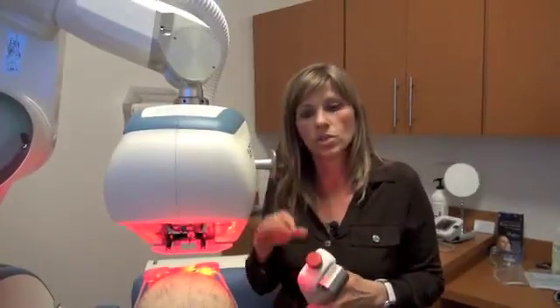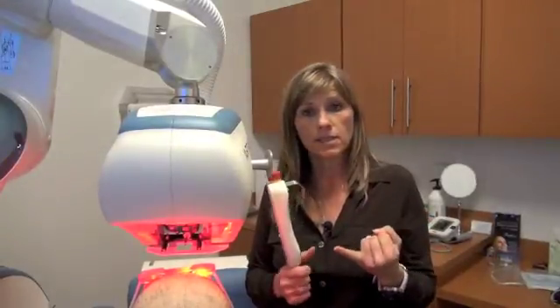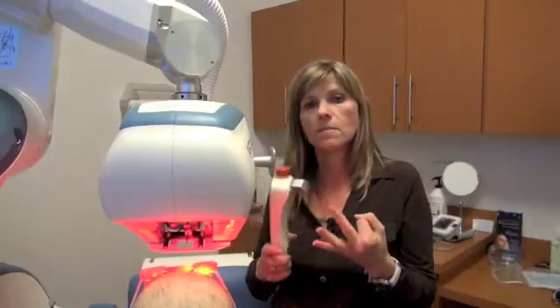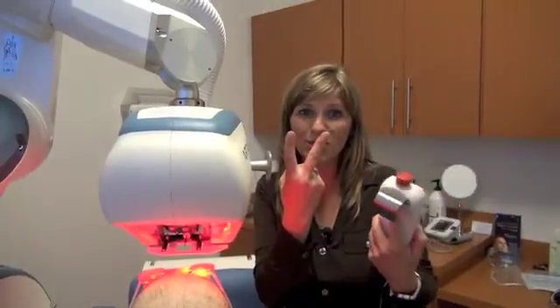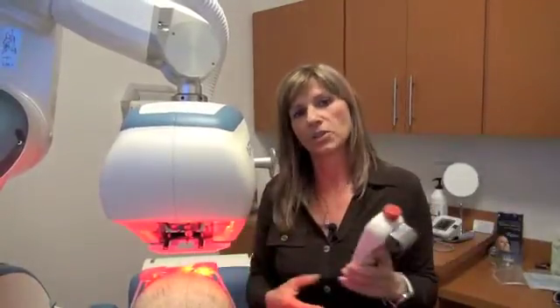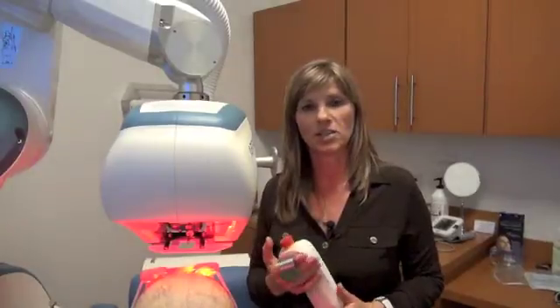Because of the noise, I will just kind of turn it for the purpose of this video. But what I want to stress — it's a very safe system. The safety is built within the system. The safety is given to a physician and anyone around. There are four buttons and usually two users of the system. So it is really built to be safe, and beyond that it is very sophisticated and precise. This was about the safety of the artist system.